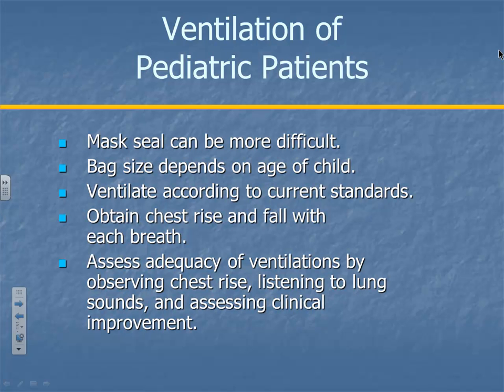Make sure that you see good chest rise and fall with a pediatric patient. How much air do you put into the lungs of a pediatric patient? Enough to make the chest rise and no more. As soon as you see it move, you're done, because it's so easy to hyperinflate or overinflate.